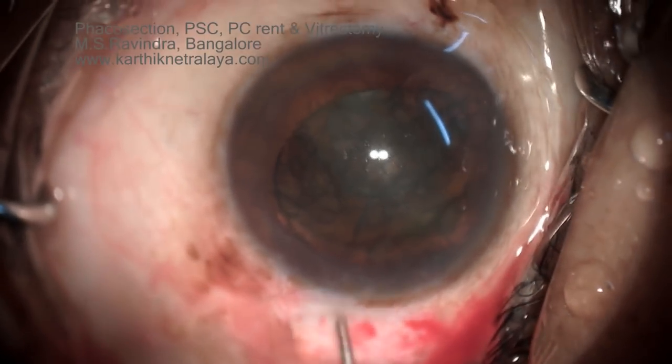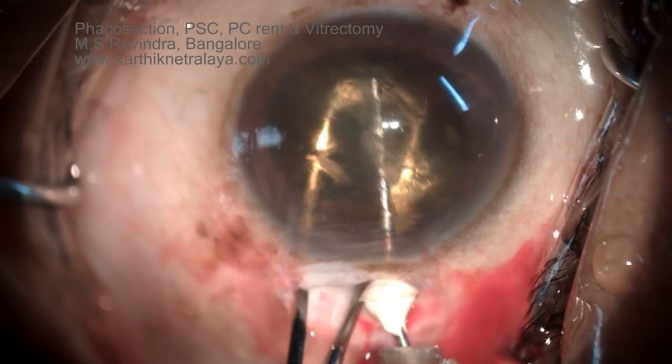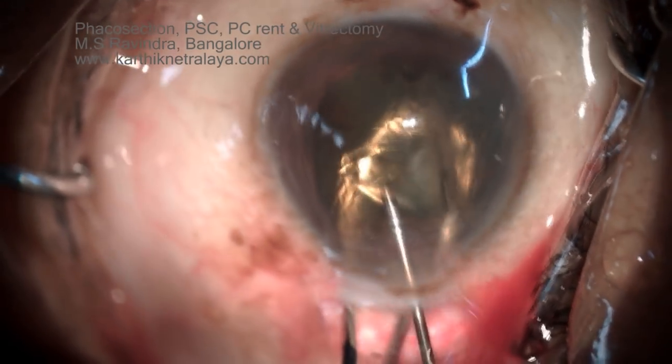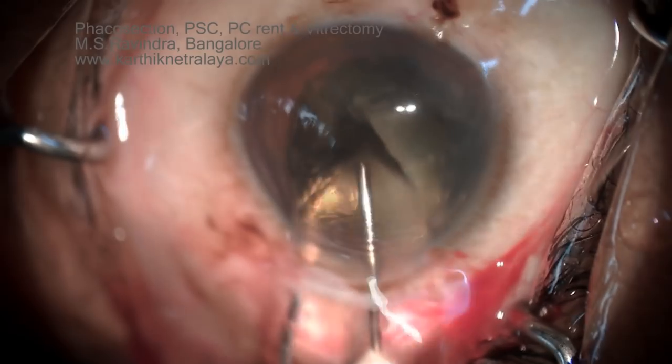The nucleus is rotated into the anterior chamber, though part of the nucleus is still in the posterior chamber — an undesirable situation. Never try to push it forcibly. The safe maneuver is applied when a portion of the nucleus is still in the posterior chamber.